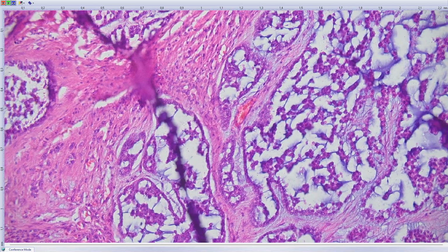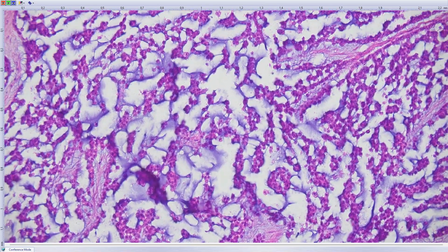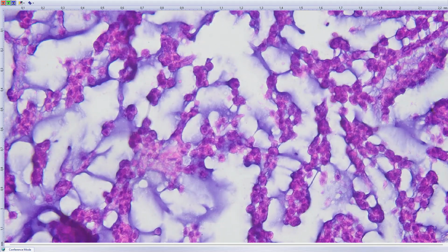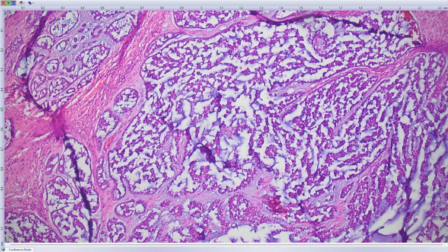They make isolated groups or small groups in this myxoid stroma, or some kind of trabecular growth pattern, and even in high magnification, if we can do it, they show irregular nuclei and eosinophilic cytoplasm. The immunohistochemical examination shows that it's really not a soft tissue tumor, but an epithelial neoplasia. There were cytokeratins positive.